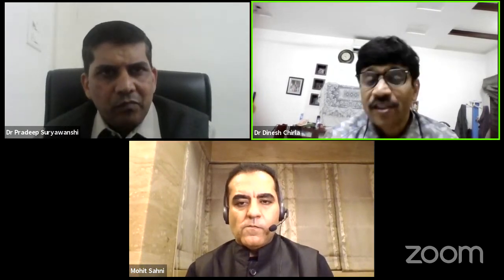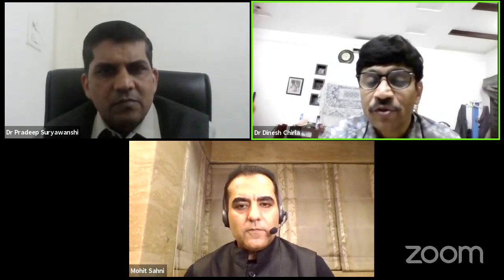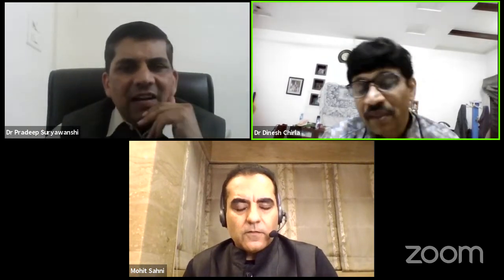Yeah, very nice. That's what our cardiologist also says. There's one window which is open for everyone. You can use the subcostal view, and you probably will get decent information from it. But I know it's easy for someone experienced to say that, I think you need a lot of practice to get that information. I will just add one more thing, Dinesh.